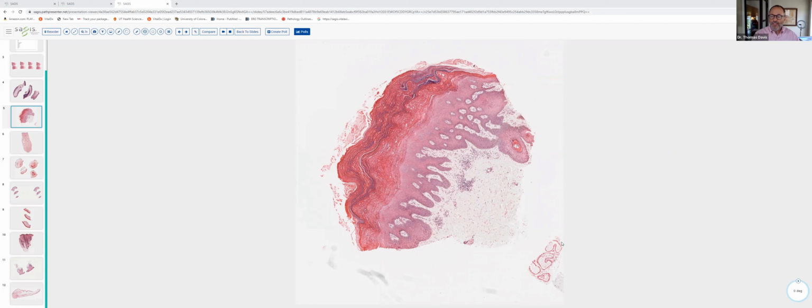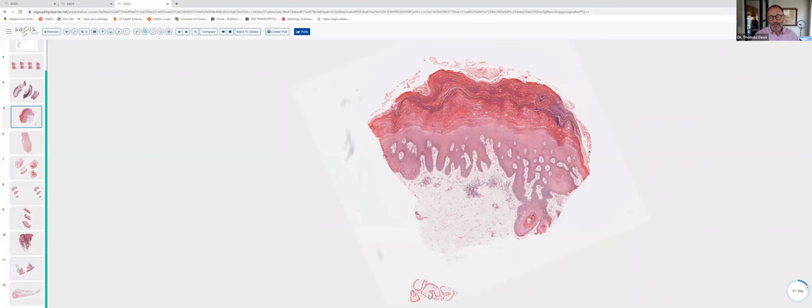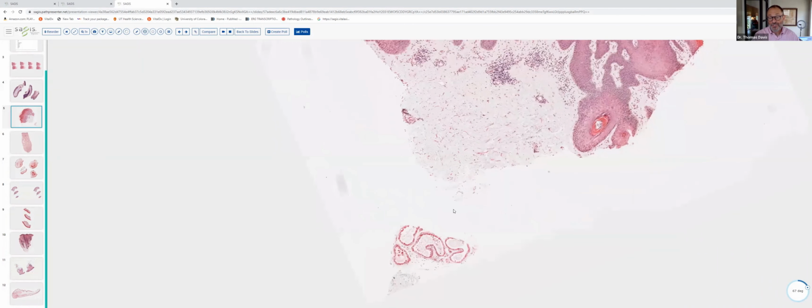Our next biopsy, this particular specimen was from the axilla. And the key features here that are indicative of an axillary site are somewhat subtle. Down at the base of the specimen, somewhat separated, there were enlarged apocrine glands.